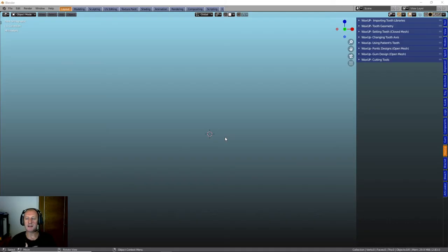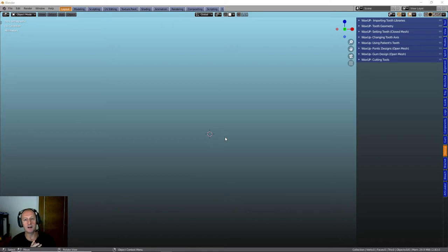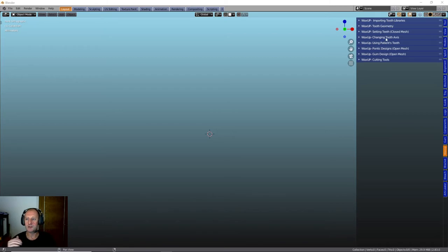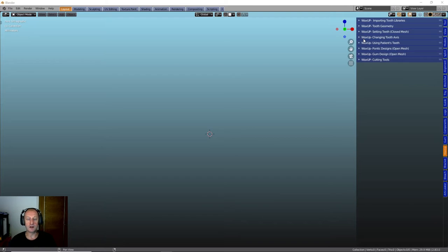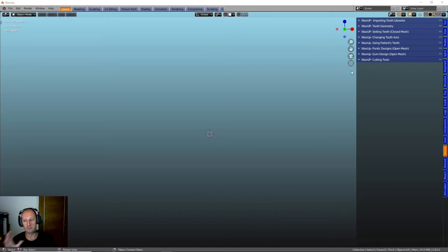This is the environment that you're going to open up when you get the Wax-Up module onto your computer. Down here we have all the different areas and different menus that we can use to create diagnostic Wax-Ups and temporary crowns and then put gum work and cutting tools and bits and pieces. So we'll go through each one of these.